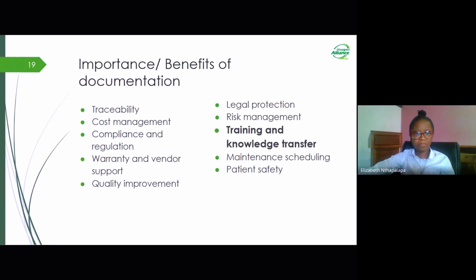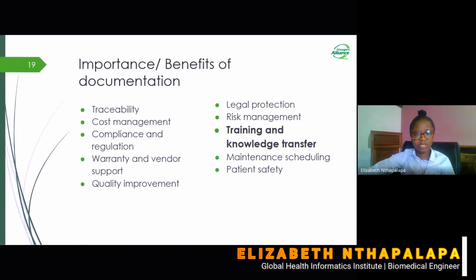Another benefit that we get from documentation is training and knowledge transfer. There is proper training and proper transfer of knowledge for the people working in the maintenance workshops. Each and every record that we have pertaining to the equipment maintenance procedures, if they are well documented, ensures that the knowledge can be transferred from one personnel to the other. So if there are any changes happening in the workshop, we are able to transfer even the details of each and every piece of information that was done in the workshop.